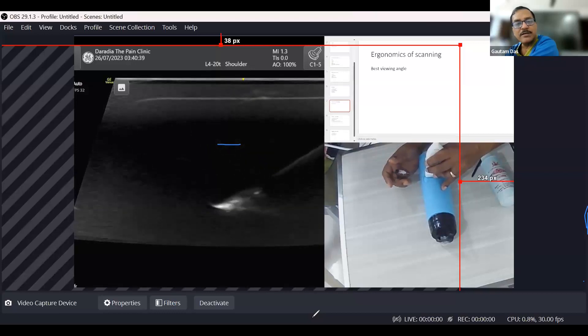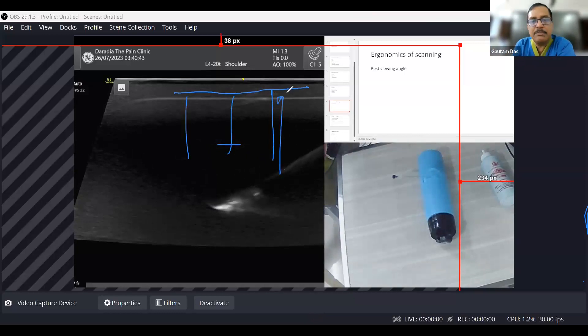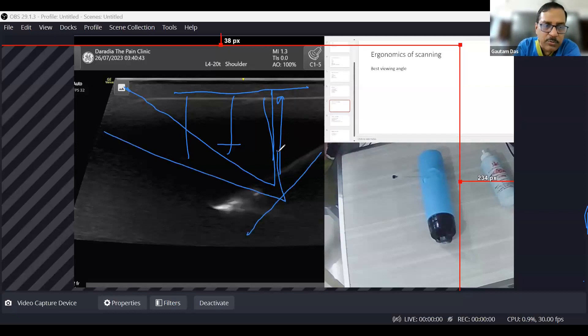So why is this happening? The ultrasound beam travels like this from the probe. If the beam is reflecting straight back, the needle appears hyperechoic. But if the angle is increased, the reflected beam goes away from the probe and we are not able to see the needle.